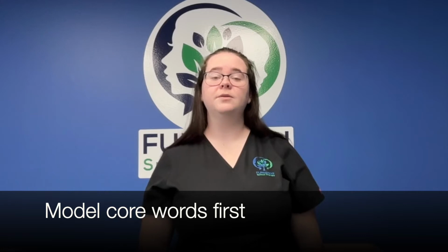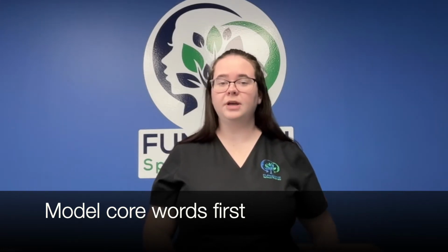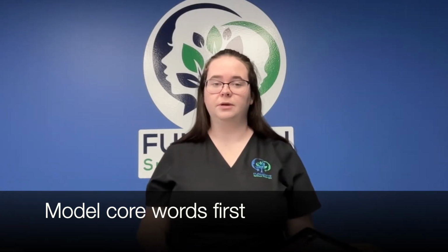Tip 2, focus on core words. Core vocabulary are the words that we use most frequently and are typically the home page or only page of an AAC device. When deciding which word to model for a given phrase, default to these core words. Not only are they used more frequently, but they're also easier to access. This is why I would model go in the phrase, let's go to the store.